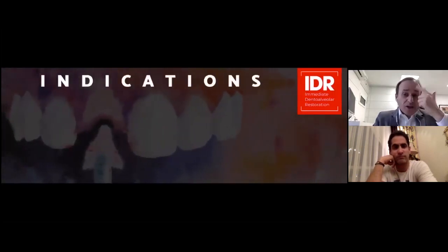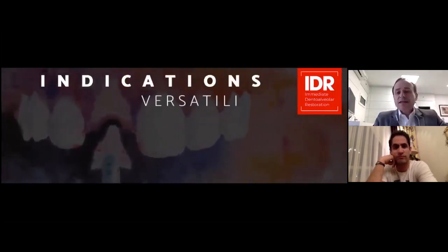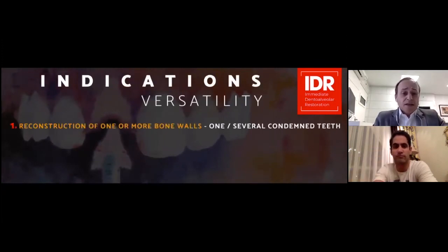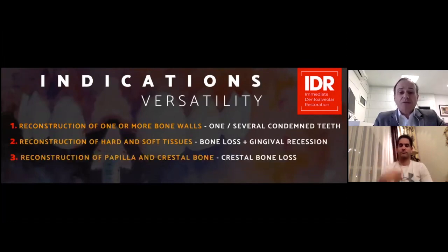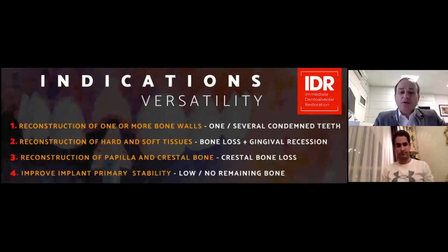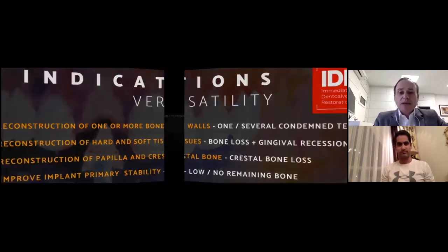And how about the indications of the IDR technique? This technique has versatility. It can be applied in the reconstruction of one or more bone walls, as you saw in many clinical cases, to restore one or several condemned teeth, the reconstruction of hard and soft tissue when we have bone loss in combination with gingival recession, the reconstruction of papilla in the crestal bone in case that we have crestal bone loss, and to improve implant primary stability in case that we have low or no remaining bone.